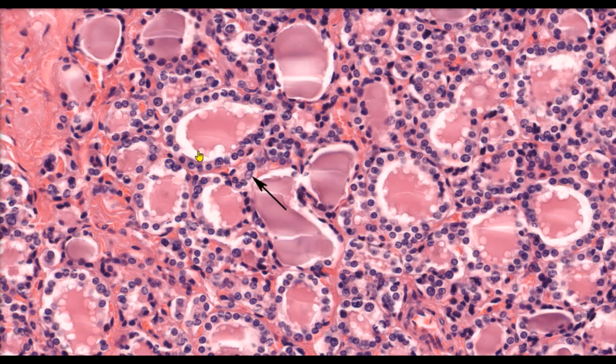The secretory epithelium varies in height. So squamous or cuboidal cells aren't very active. They're not secreting much product. But if we saw very tall columnar cells, those cells would be very active. In the center of the lumen, again, we see the colloid, that pink gel-like mass, that contains a precursor to thyroid hormone. So that's our first hormone produced by the thyroid gland.